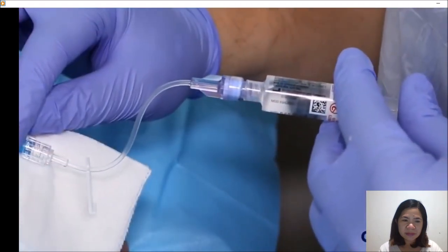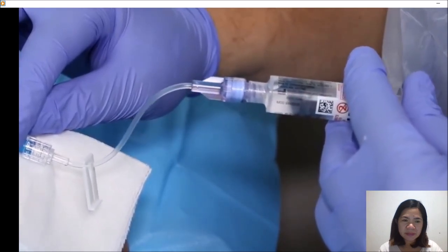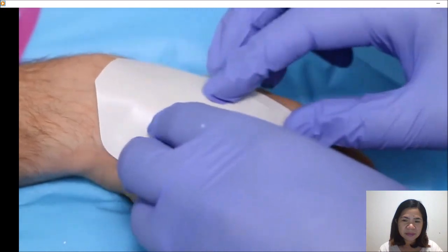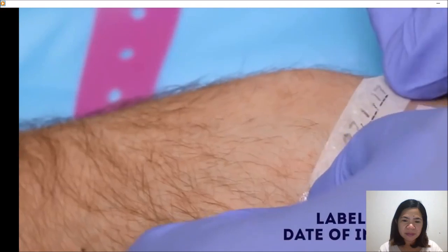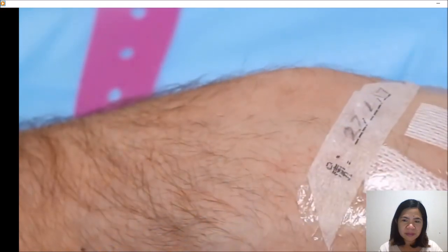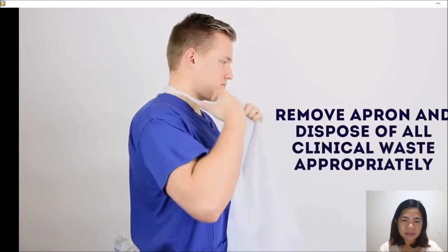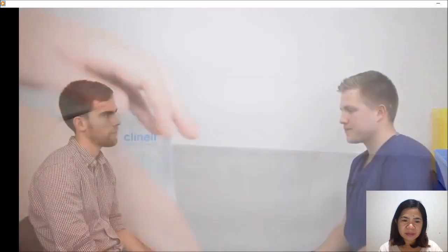James, I'm just going to flush the cannula now. Do let me know if there's any pain. Thank you, James. We're all done. Are you feeling okay? Yes, I am. Thank you. Okay, brilliant. Thank you.